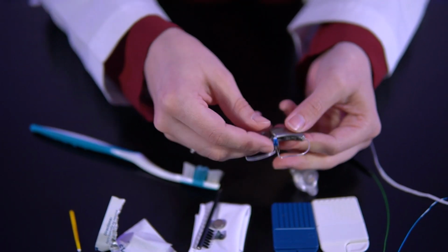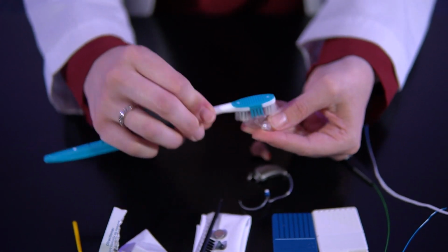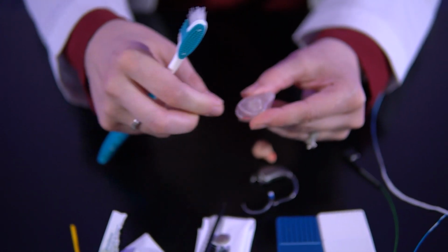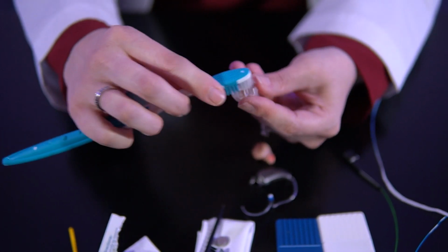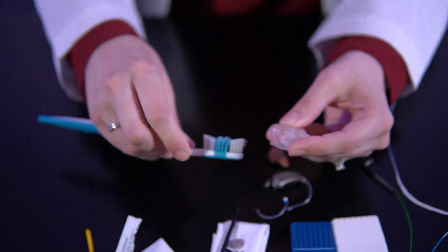And then after you've done all of that and your hearing aid's nice and clean, we've cleaned this part again. We open our battery door, get in there, clean your mics.